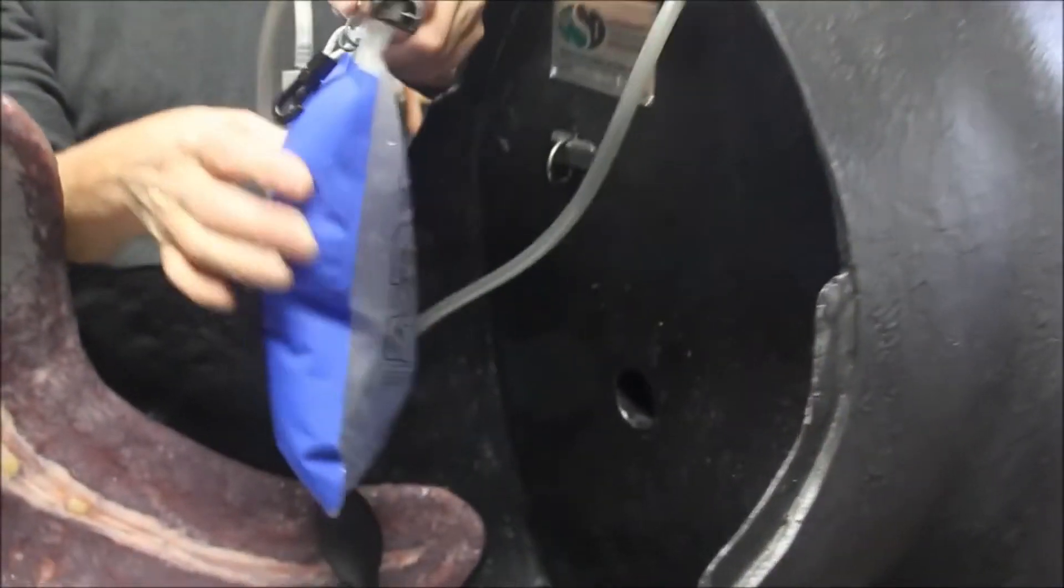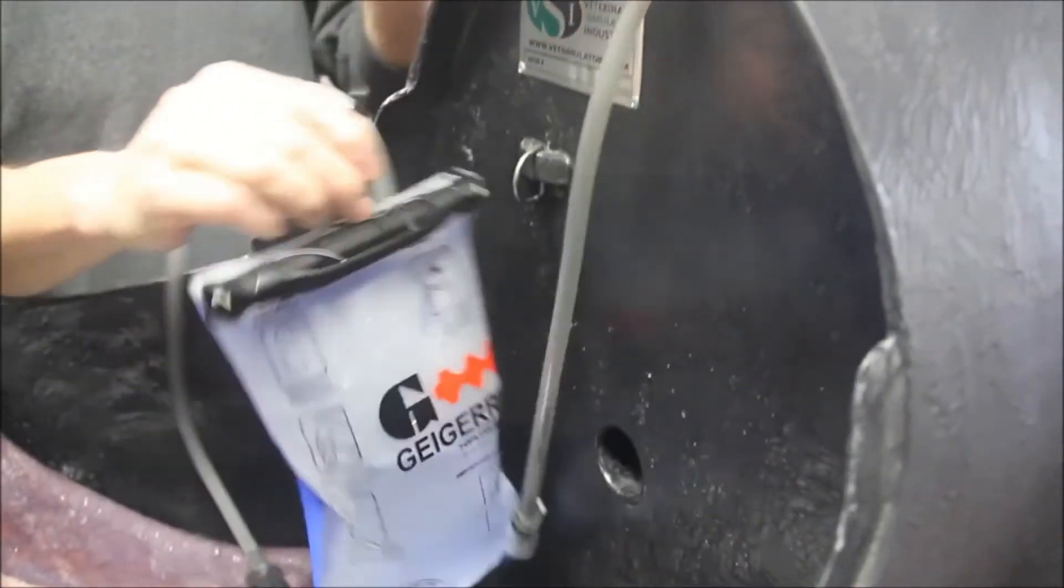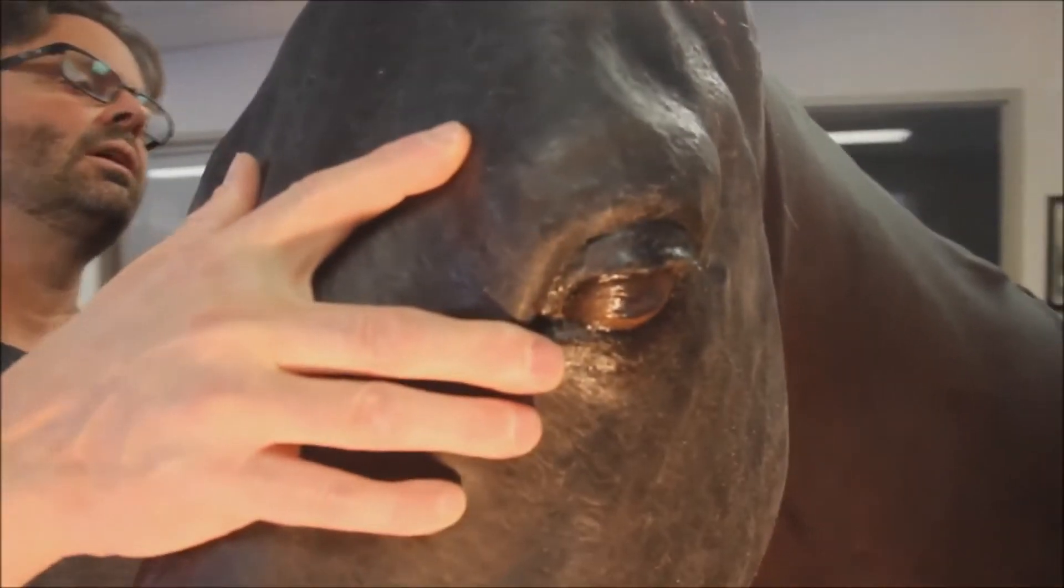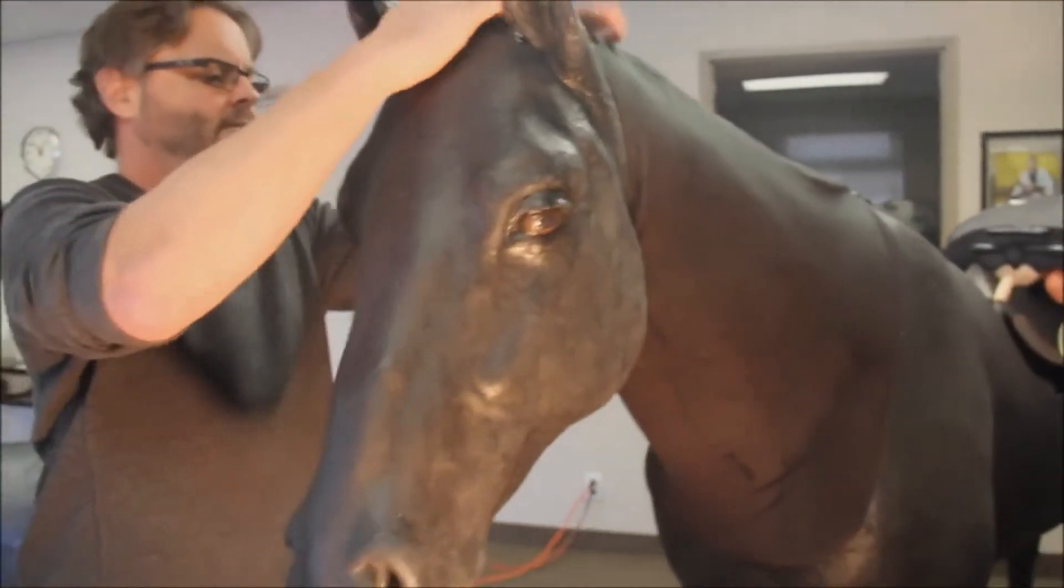The veins are represented by 50 cm long thin walled latex tubing which can endure multiple punctures. The head uses the same attachment type as the neck and simply slides onto the receiver in the neck. The horse also features an open mouth for applying a bridle.